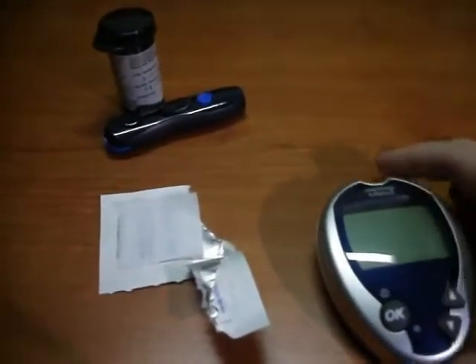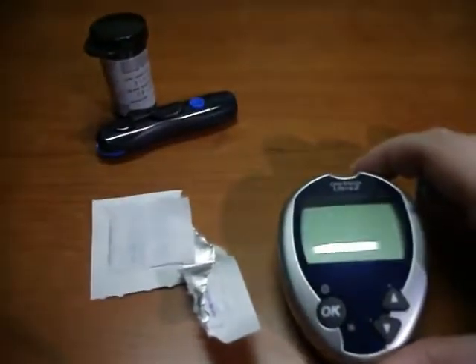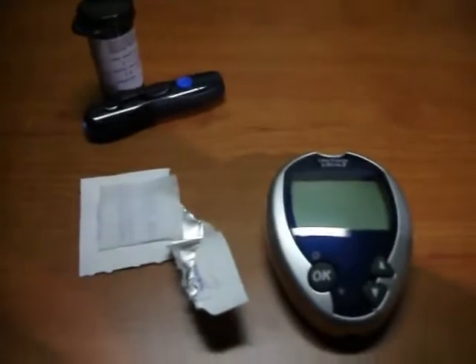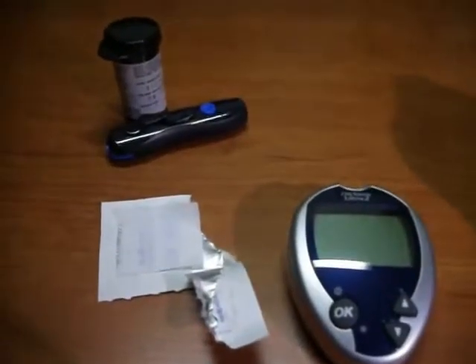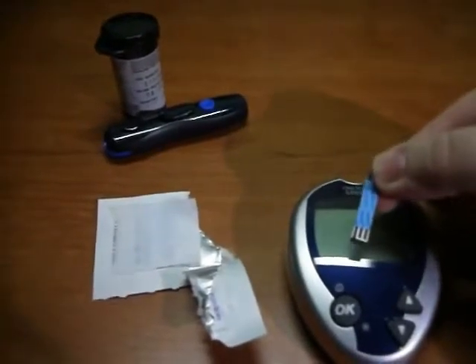The system that I am demonstrating today is the OneTouch Ultra 2 using the Delica lancing device and the OneTouch Ultra blue test strips, seen right here.